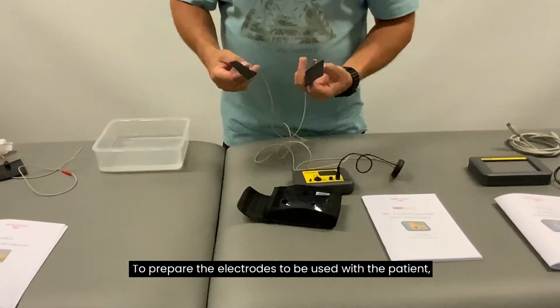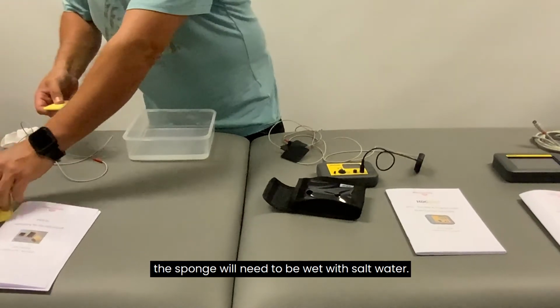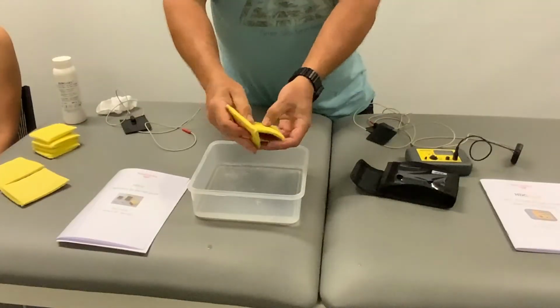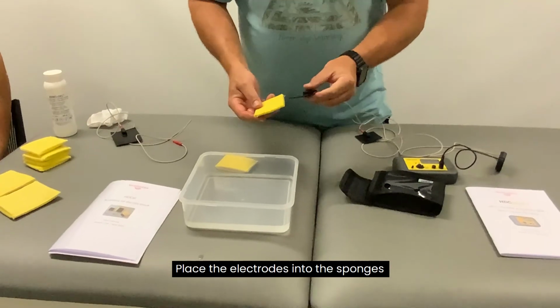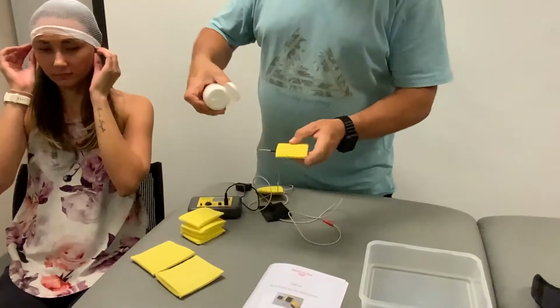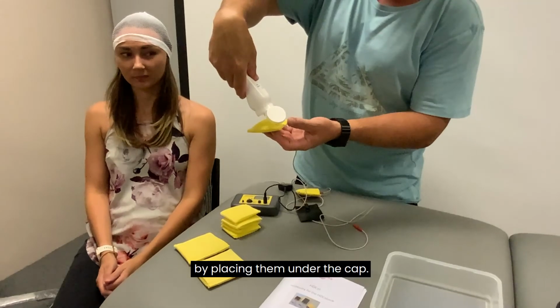To prepare the electrodes to be used with the patient, the sponge will need to be wet with salt water. Salt water will give you better conduction than standard tap water. The sponges have to be damp. Place the electrodes into the sponges. Then put the cap onto the patient. Apply the gel onto the sponge, and put the sponges onto the patient by placing them under the cap.